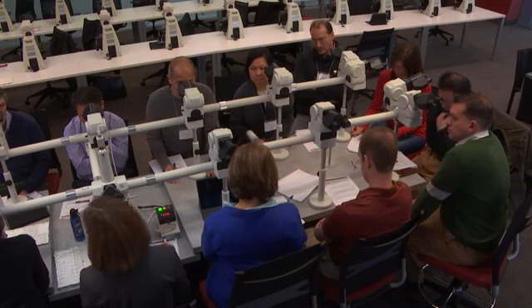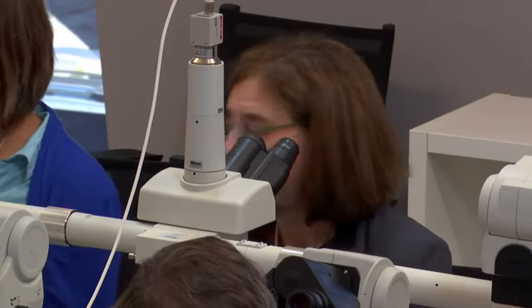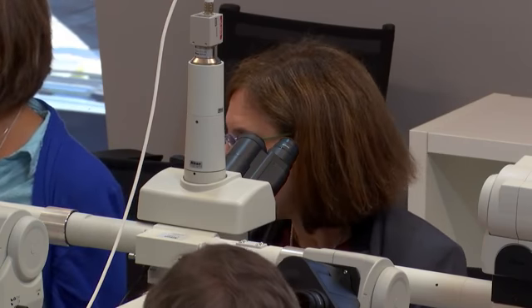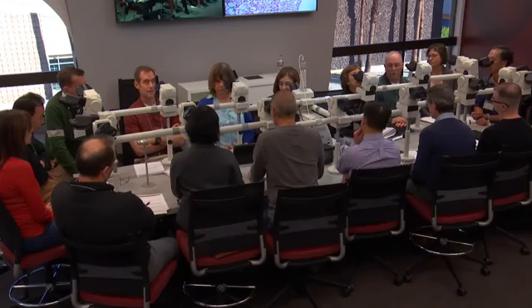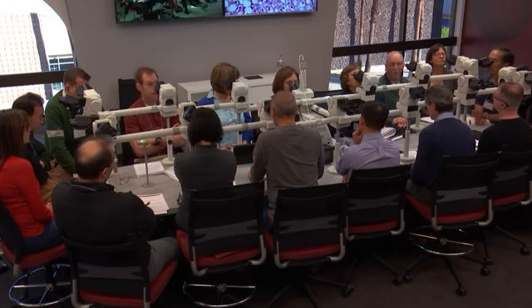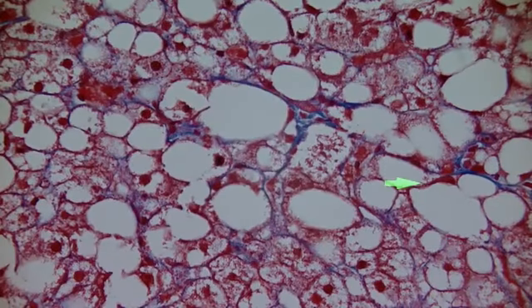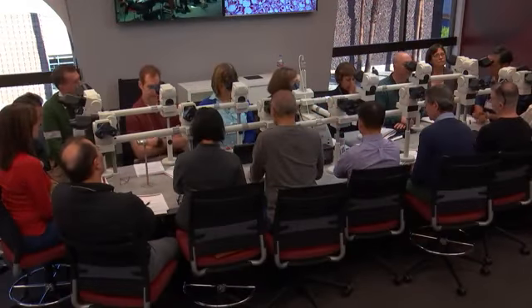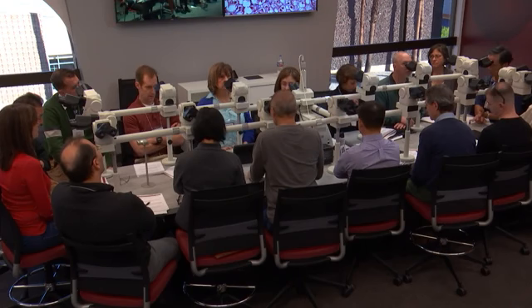Now, what I sometimes do, and I'm sure some of you use it too, is the hedge statement of features of. Anybody use that? Features of steatohepatitis. If I'm struggling with what's a balloon cell, and am I sure, or if it's mixed with chronic hep C and there's inflammation and damage and I'm not sure what it's from, I may say features of steatohep. But if I just see this pericellular, perisinusoidal, and I don't see active damage, degeneration, ballooning, it could indicate burned out disease. So I would want to see some degeneration, regeneration, ballooning, something.